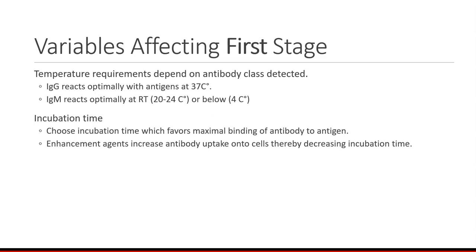to the antigen. Enhancement agents will increase antibody uptake onto the cells, thereby decreasing the incubation time. So again, just remember, once we get to the optimal, there's more antibody binding to more antigen, but there's always dissociation. If you incubate too long, it may result in the dynamics changing where more antibodies are coming off the cells than going on, and then we may end up with a false negative.